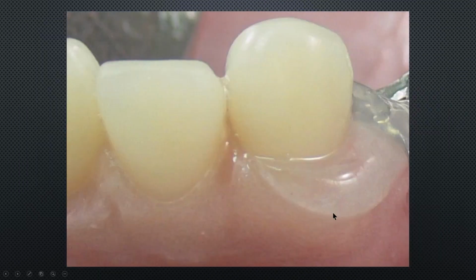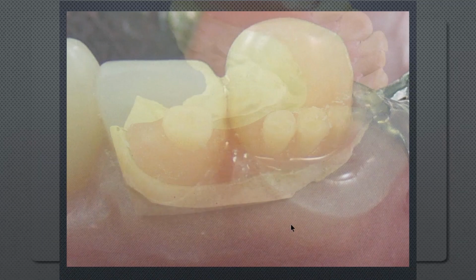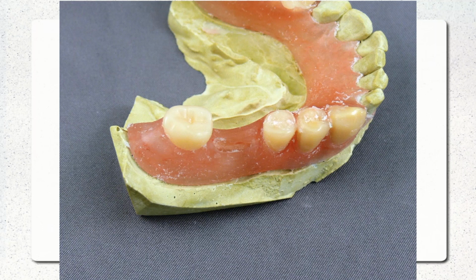All right, that was a quick overview. Myerson has videos on their YouTube page on all different types of stuff, including dealing with VisiClear as far as injecting it. So you can check out Myerson Dental's YouTube page if you want more information on the injection side of this and other things as well.